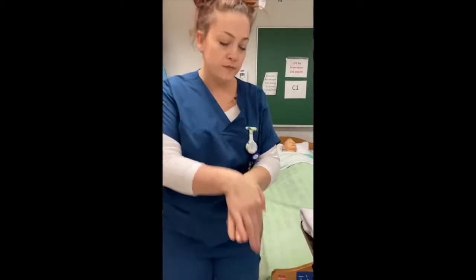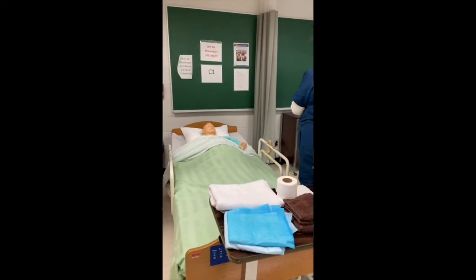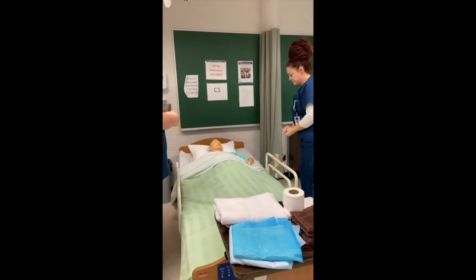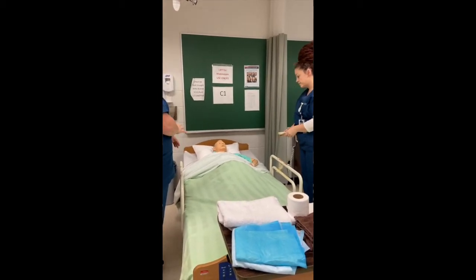In this video, Tiffany and I will be demonstrating the basic skill of peri care prior to using the mechanical lift to mobilize our patient in her wheelchair for the day. We begin by performing hand hygiene. We introduce ourselves and identify our patient. We also explain to the patient what we are about to do.